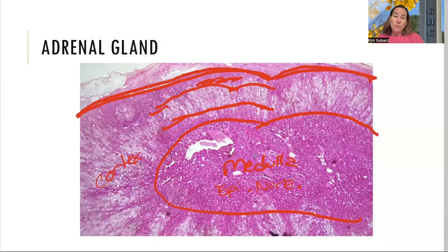It's going to help you raise your blood sugar if you are stressed out and you need energy for whatever the thing is that's causing you to be stressed. Cortisol will do that for you. It has glucose-sparing properties, and it is a glucocorticoid coming out of zona fasciculata, this lighter area here. We're going to say ZF for the cortex.